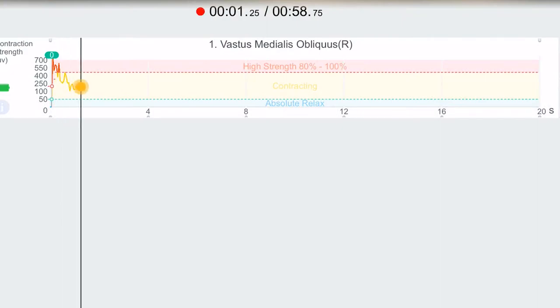I'm going to click here for the session to start. So Megan, I would like for you to try to keep the vastus medialis contracted toward the red line.